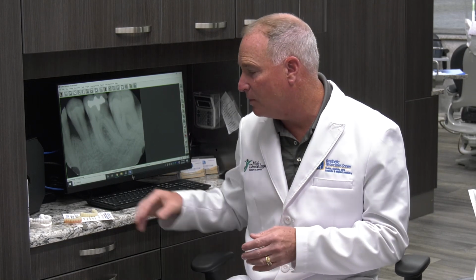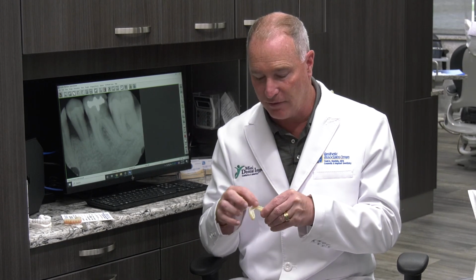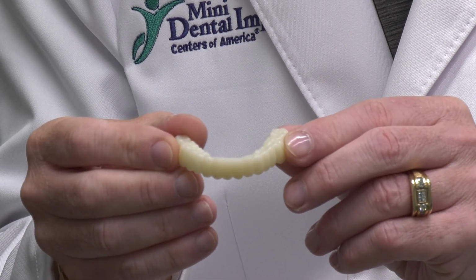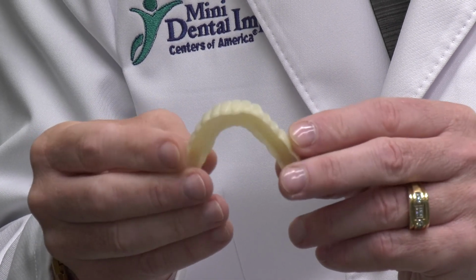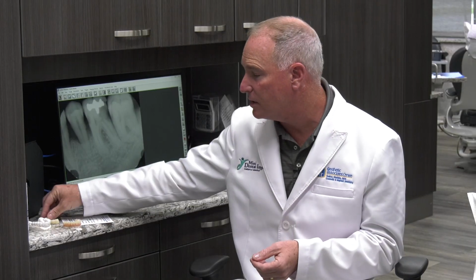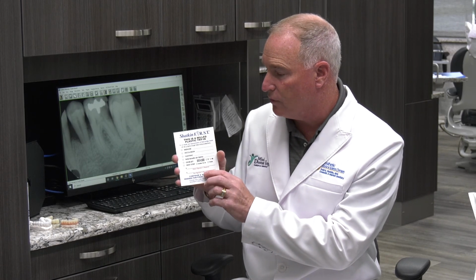The next thing we want to do is a try-in, and this is very important. You want to do a milled try-in that's troughed out so that it fits over the implants and you can check the vertical, the aesthetics, the bite, all of that stuff on a try-in. Those things can all be adjusted.